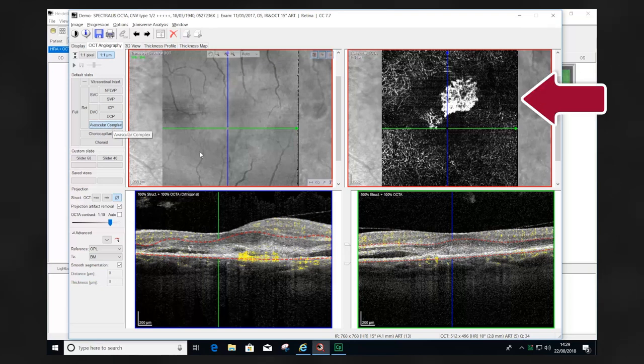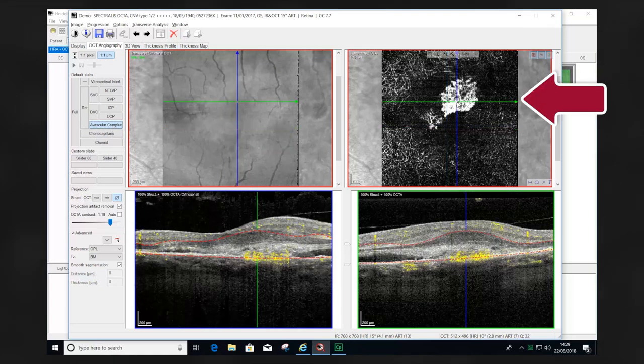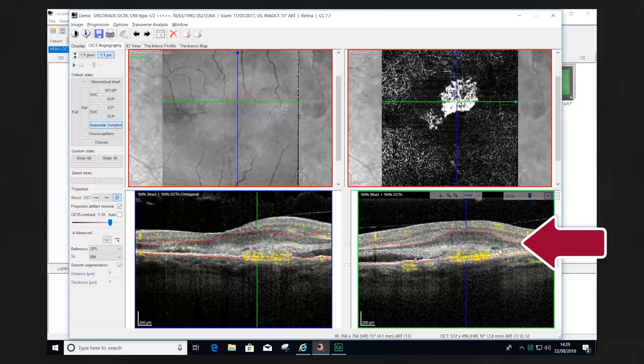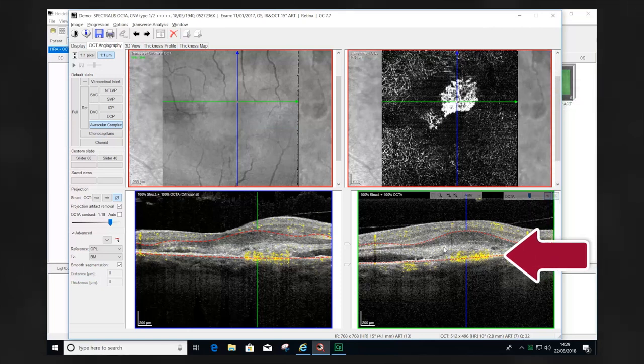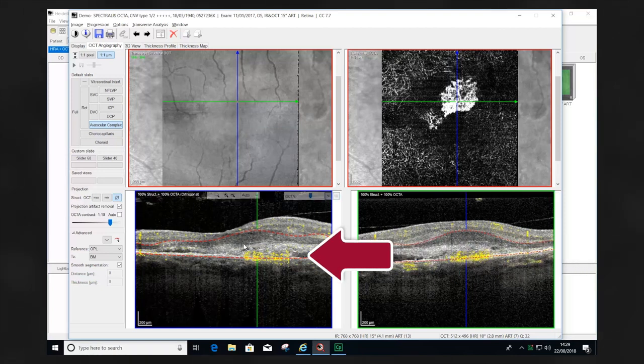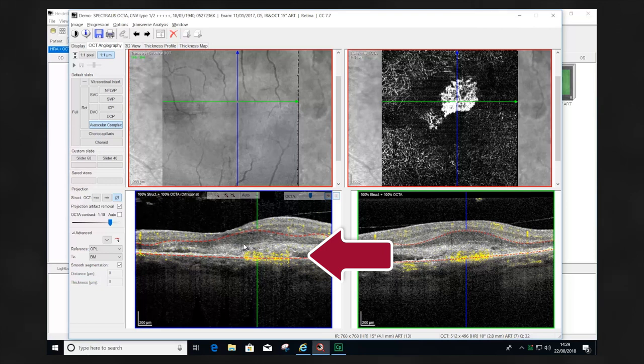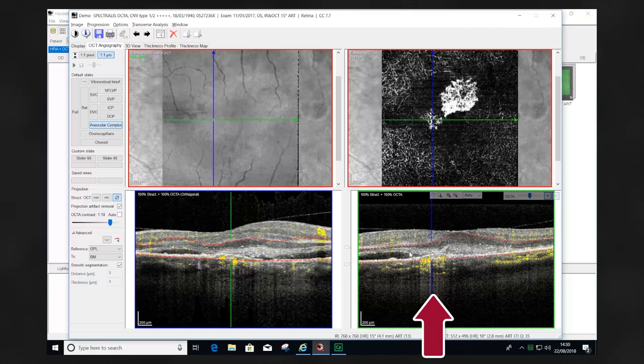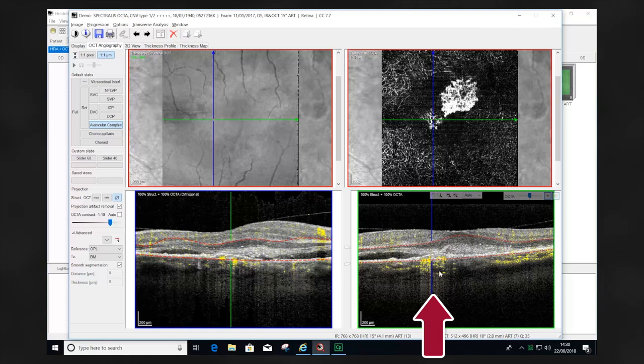The top right image shows the OCTA flow, and this bottom right image shows that the flow is anterior to the RPE. We next move to the lower left area of increased flow in the OCT angiogram, and we can see bottom right that the flow is beneath the RPE.